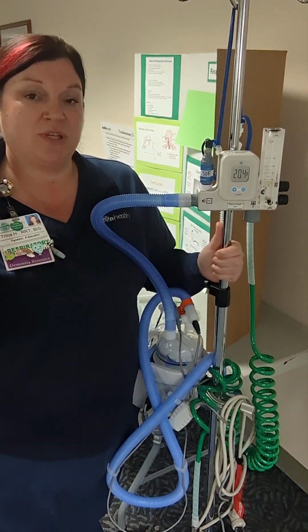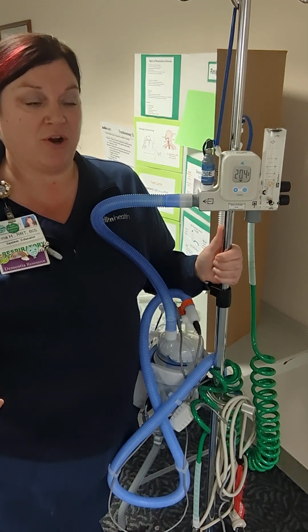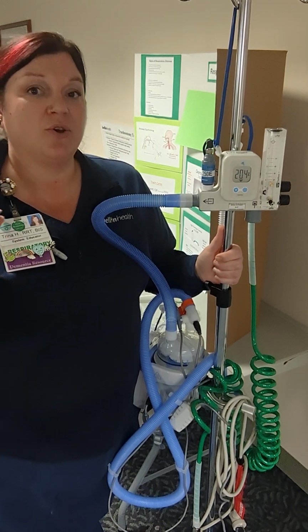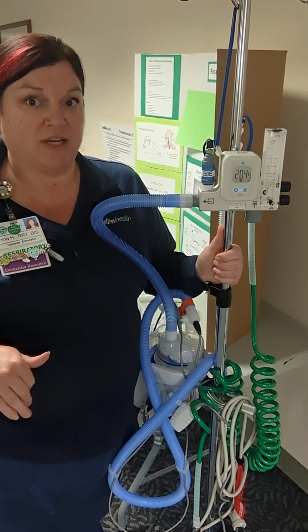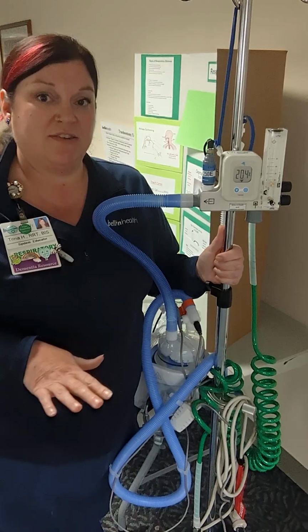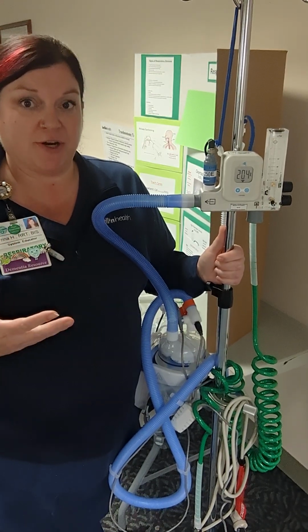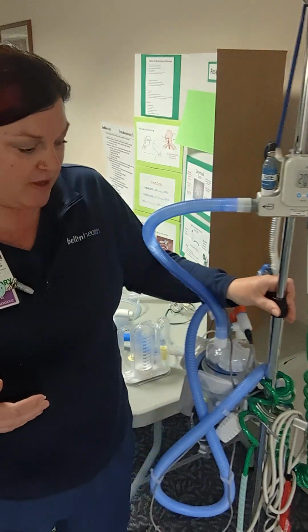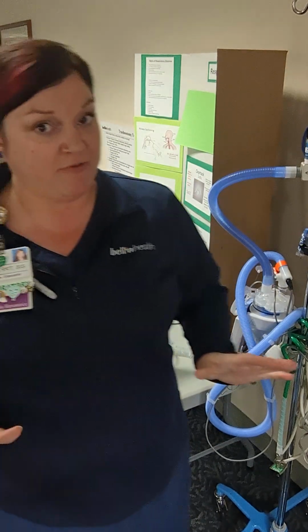Nurses are able to titrate, change, adjust any oxygen parameter on any machine. You are allowed to change FiO2 on any device we're using. Now, if we think flow is the issue, please leave that for RTs. And if we're talking about pressure, like with a BiPAP, we want to leave pressure changes for RTs as well. However, you as a nurse are able to change the FiO2, the oxygen part.